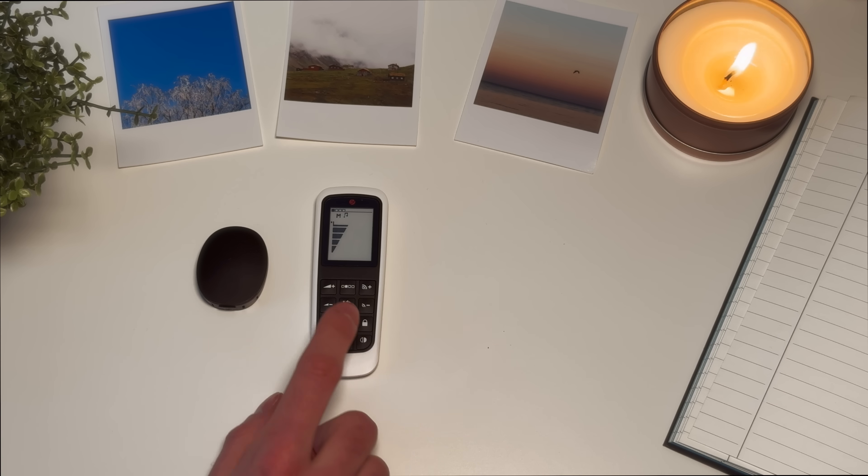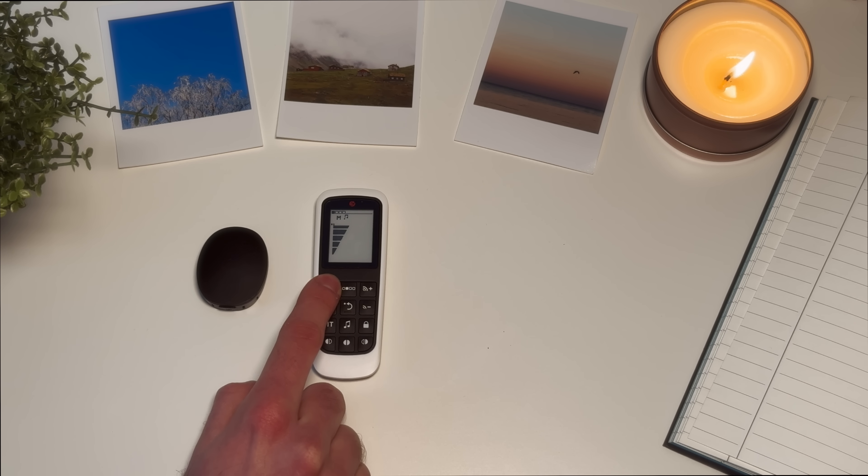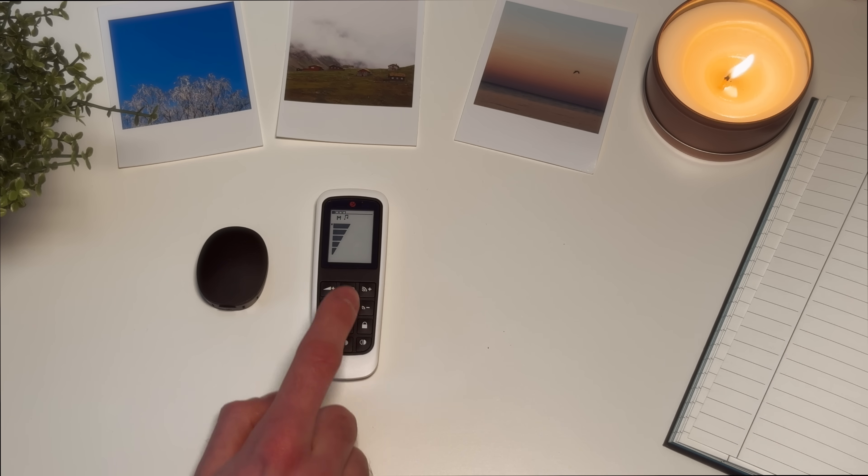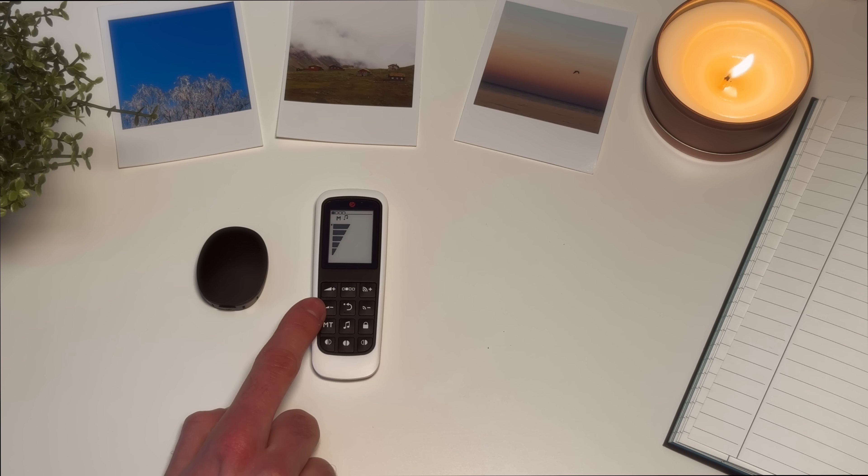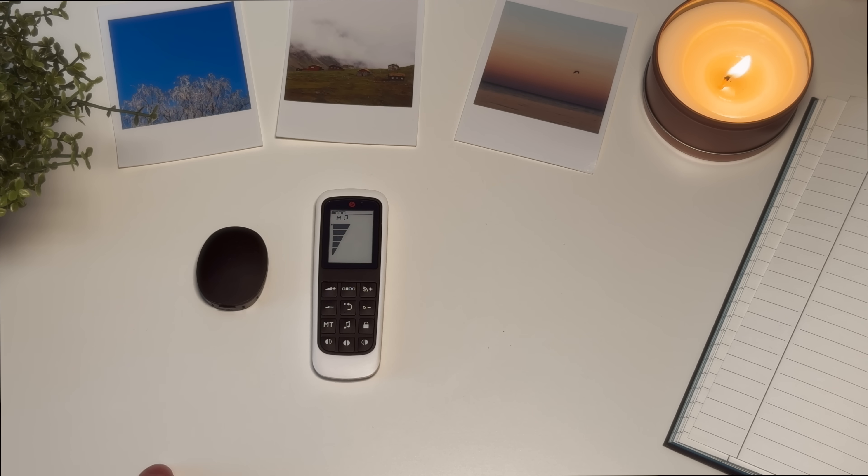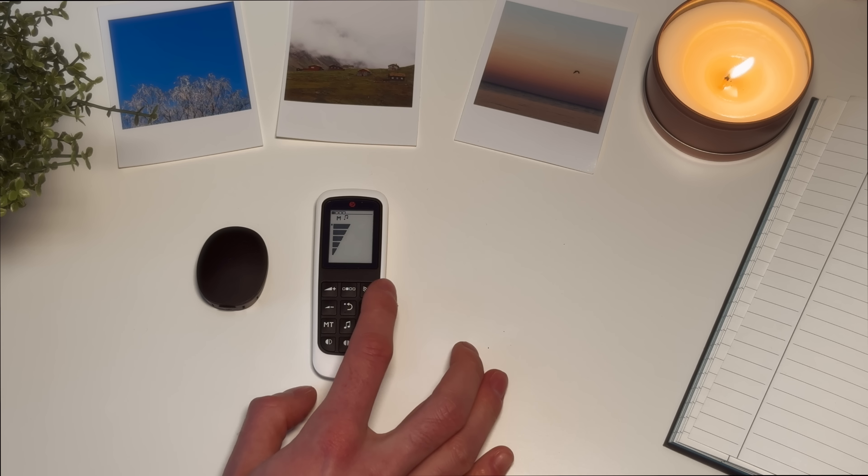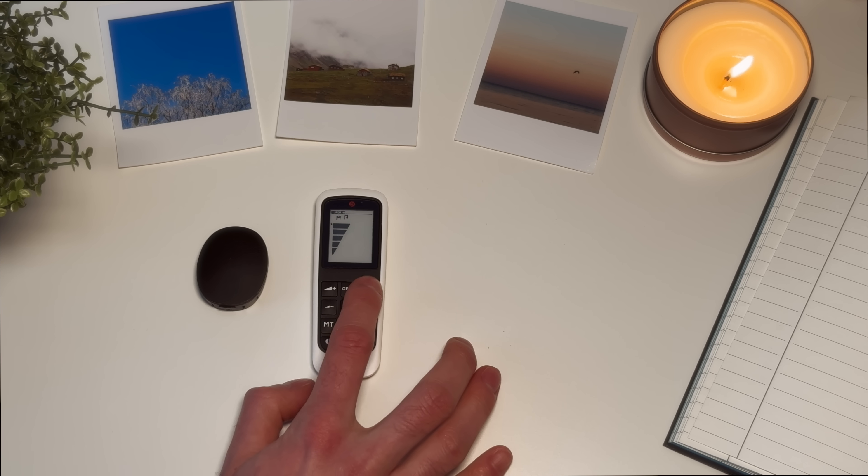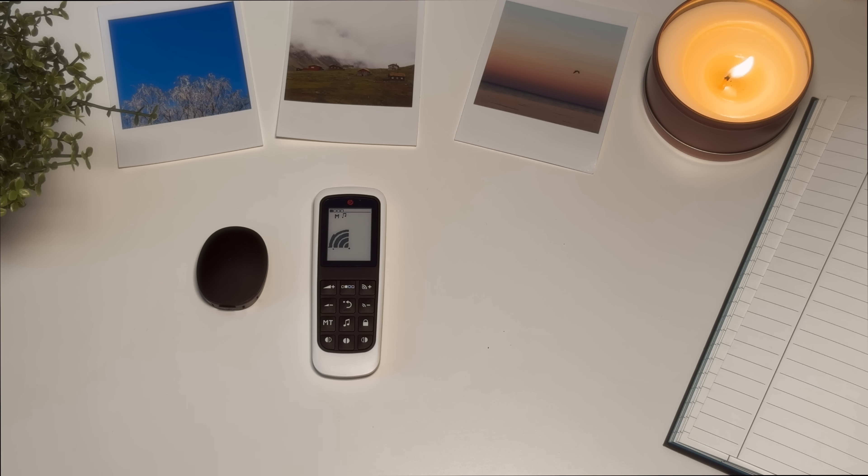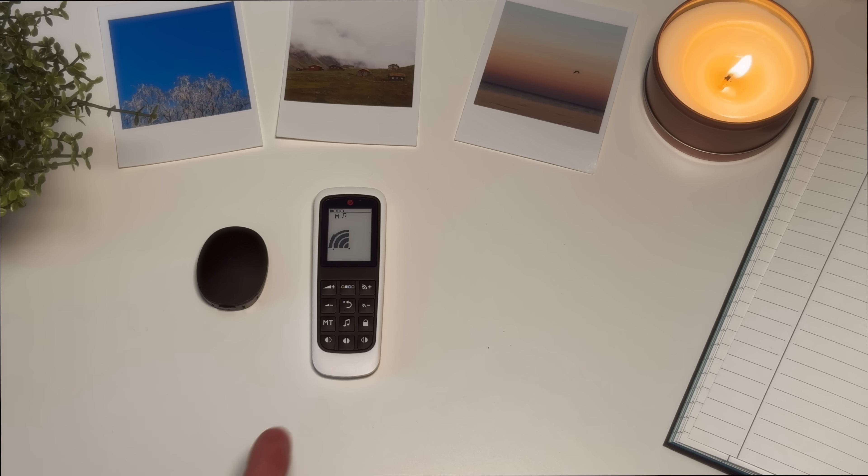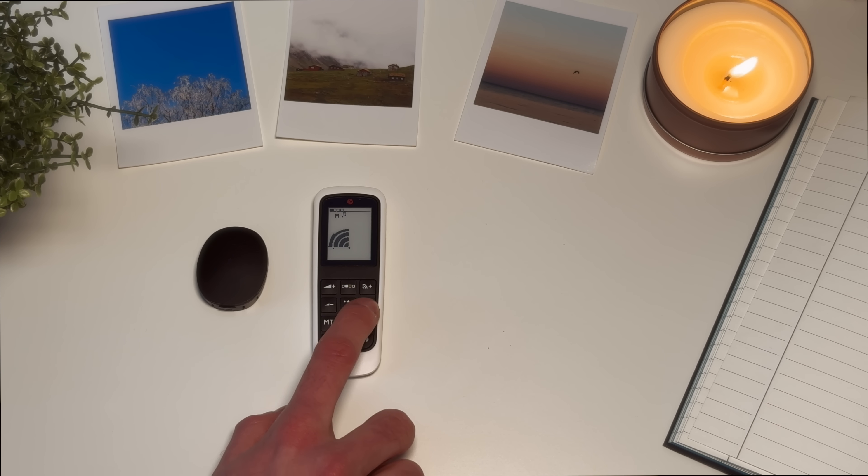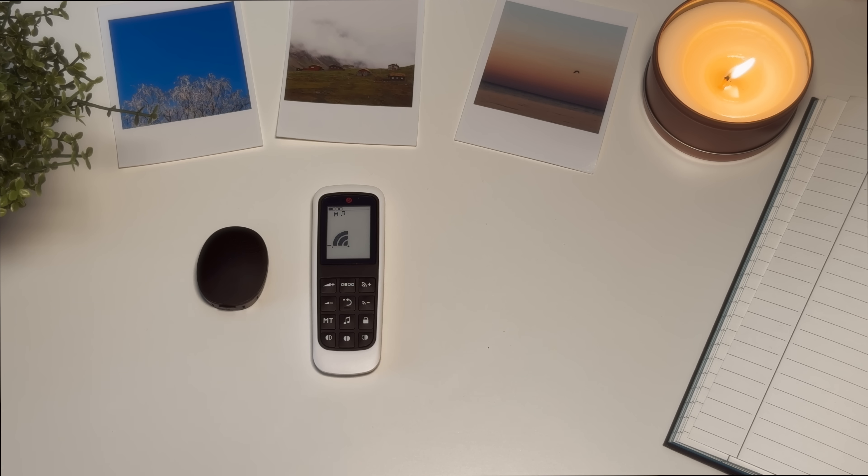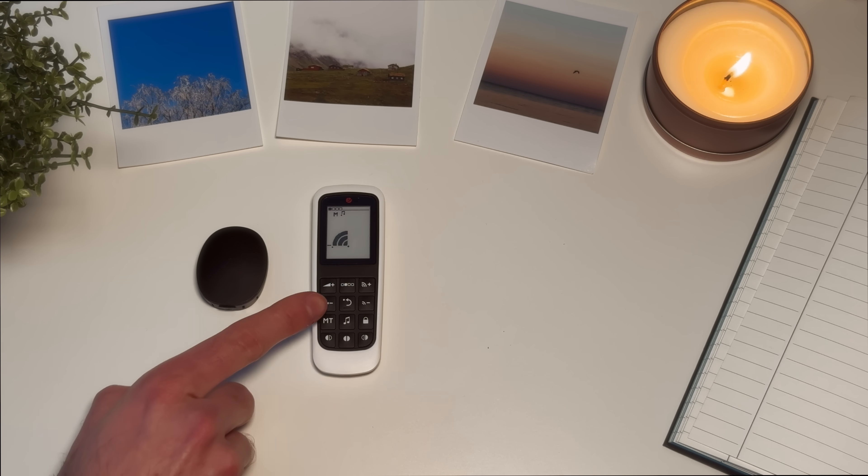To turn up the volume with Fine Tuner Echo, press the upper volume key. To turn the volume down, press the lower volume key. Press the upper sensitivity key to increase the sensitivity of your audio processor's microphones. This will increase the range of the microphones, but you may also increase background noise levels. Press the lower sensitivity key to decrease the sensitivity of your audio processor's microphones.